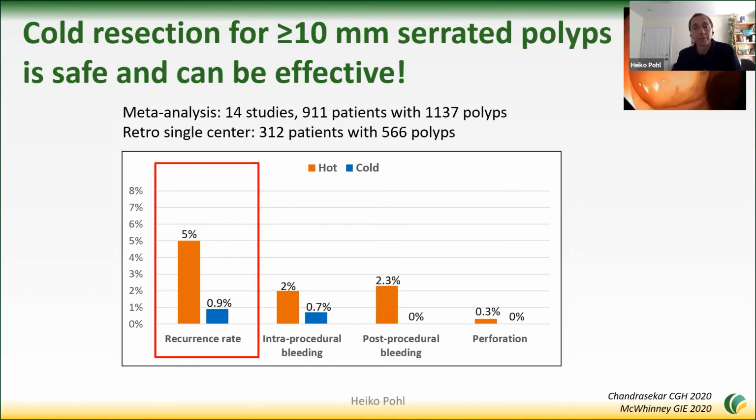So now we realize that, much as you like doing cold snare resection, maybe not all polyps can be resected cold, and that's not just a size issue, but the bulkiness. We need a measurement for bulkiness, by the way. But it's probably good for flat polyps.